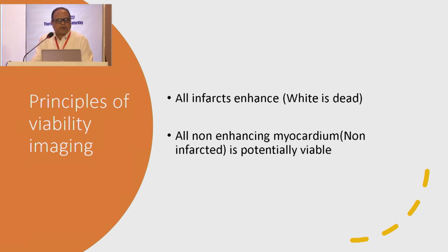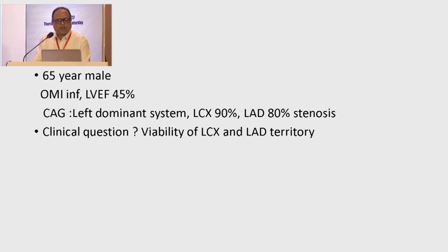So the principle of viability imaging is that all infarcts enhance. Actually, after MI, from day one, all infarcts remain white, and it lasts for life. And all non-enhancing myocardium is potentially viable.